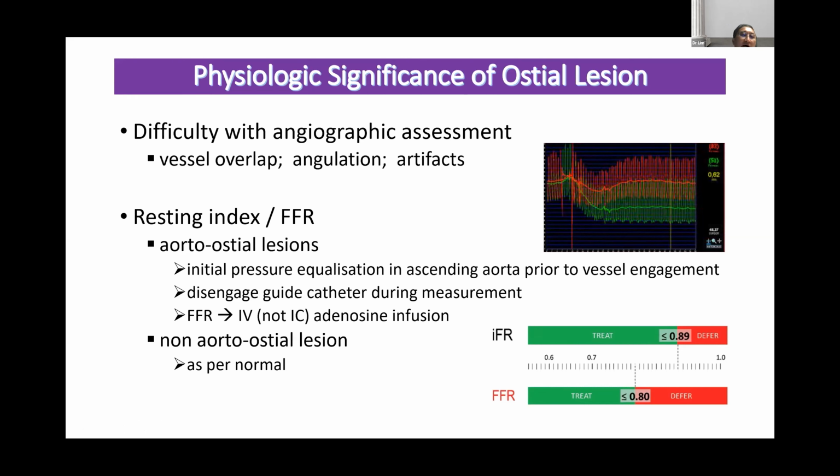And to perform the hyperemic FFR, IV adenosine and not IC adenosine is preferred. For the non-aortic ostial lesion, it can be performed as per normal.